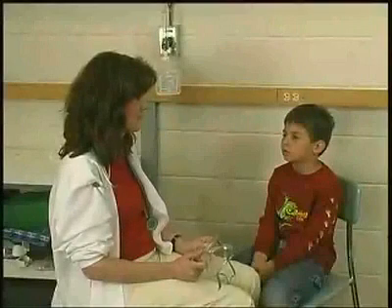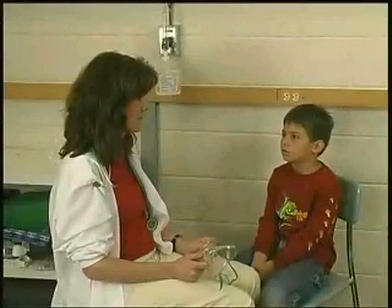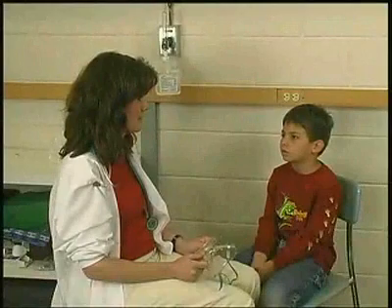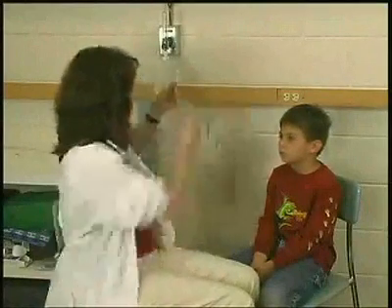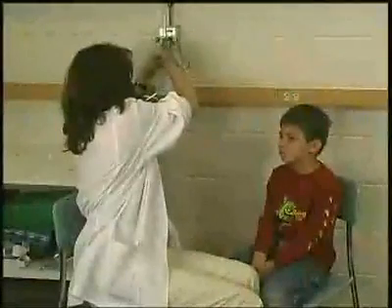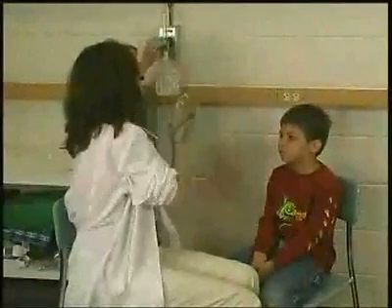Low flow oxygen devices, because they do not fully meet the patient's ventilatory demand, deliver variable oxygen percentages based on the oxygen flow rate, breathing pattern, and depth and rate of ventilation.